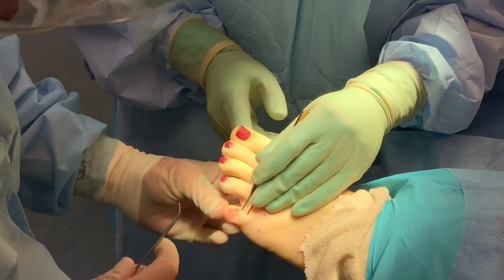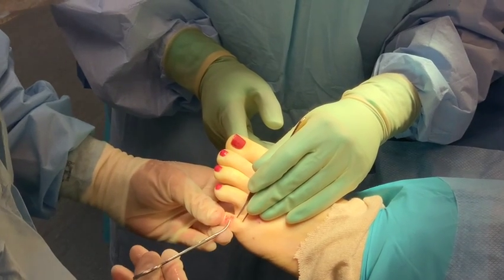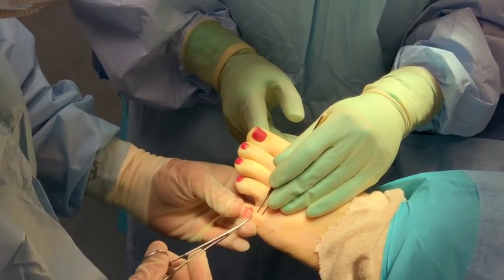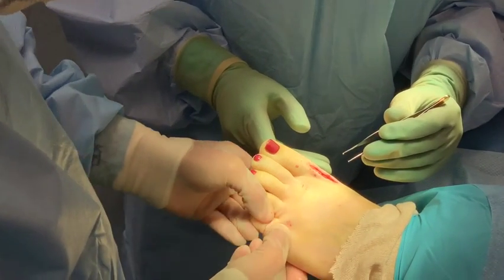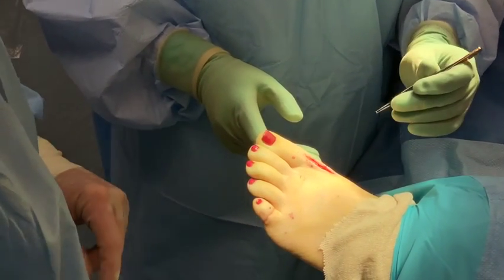Then you grab the pin here — it's super easy — grab the tip, insert it in the hole, and press it. Voila, beautiful — perfect straight toe.